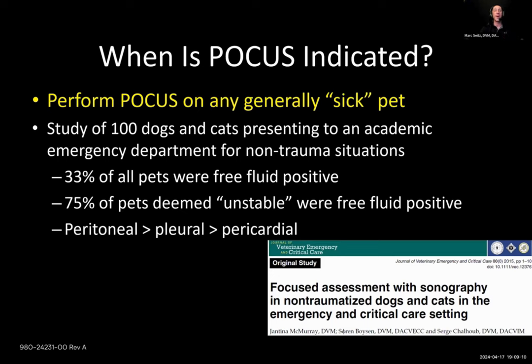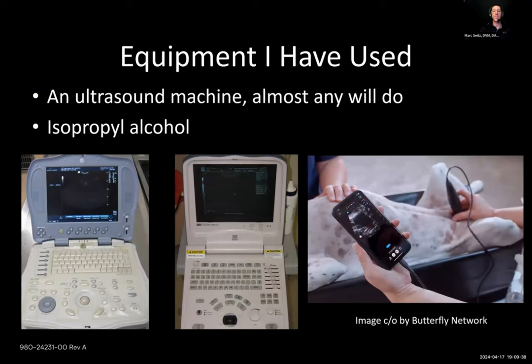And same thing in ER. There's a huge argument to build it into your emergency fee. Fortunately, the clinics I worked at did that. We even do that at state. Our clinicians are allowed to do a point-of-care ultrasound with that emergency fee that includes the physical exam. So I think batching it into your sick visit makes a lot of sense, and it can really help increase utilization, give you practice, but more importantly, catch things that you might otherwise miss.